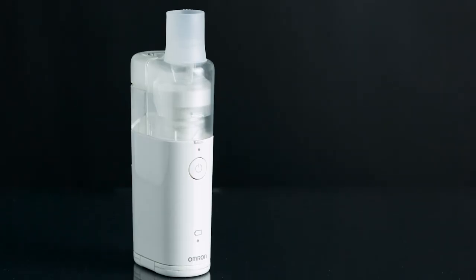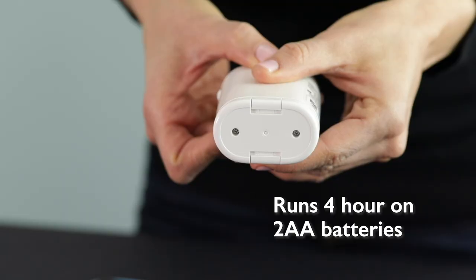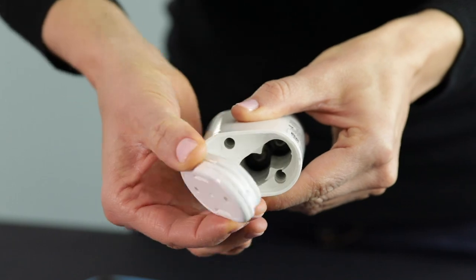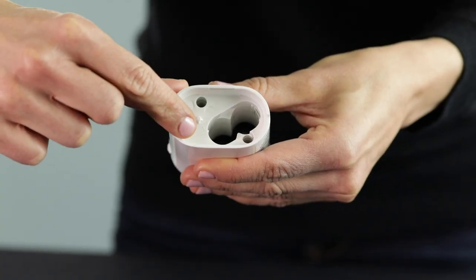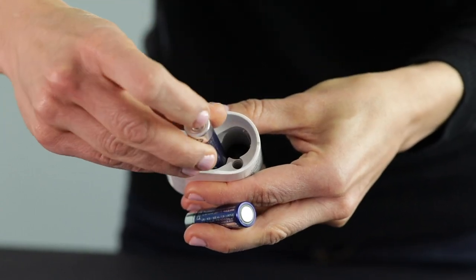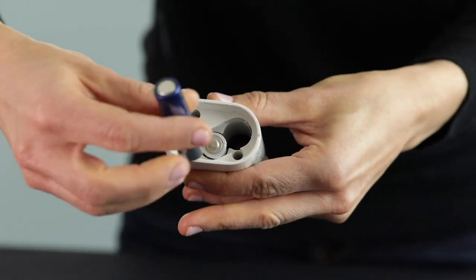This unit is battery operated and runs for up to four hours on just two AA batteries, which is about 30 treatments depending on the amount of liquid medication you need. When inserting the batteries, make sure you do one up and one down as indicated by the small positives and negatives inside the unit.